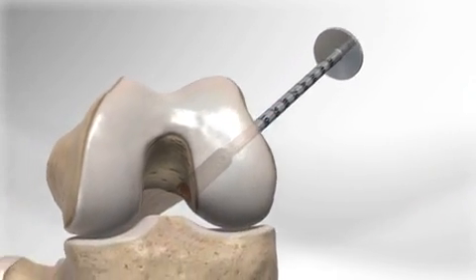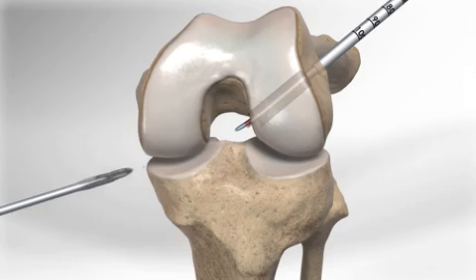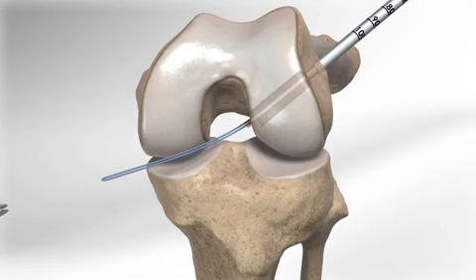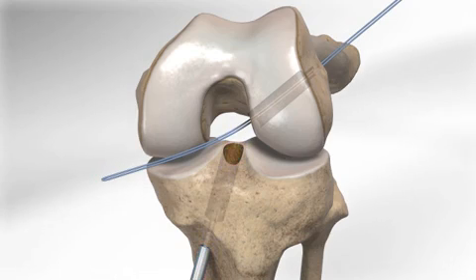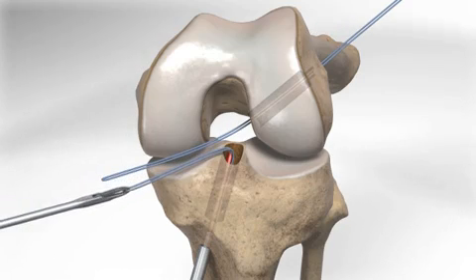The flip cutter is removed and a suture is passed into the joint and out of the skin for later graft passing. Using the flip cutter again, a socket is then drilled in the area of the ACL attachment to the leg bone, or tibia. A suture is also passed into the joint and out of the skin for tibial graft passing.